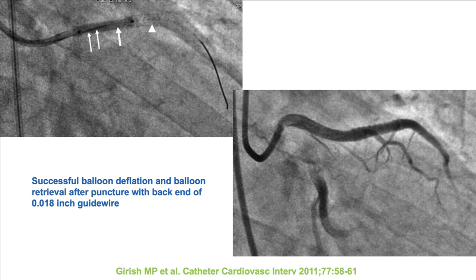In this particular case, puncturing the balloon was done by delivering the wire through the guide catheter pulled all the way toward the balloon. Sometimes a separate system may be needed — for example, a second guide catheter with a guide extension or an over-the-wire balloon — to bring the back end of a wire close to the balloon without injuring the proximal coronary artery.